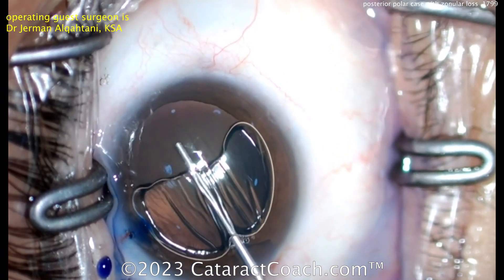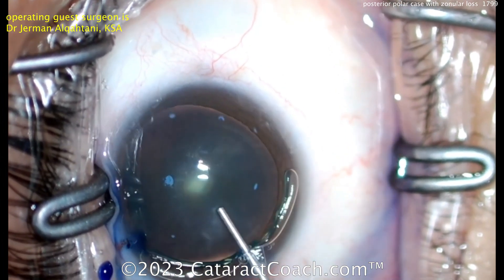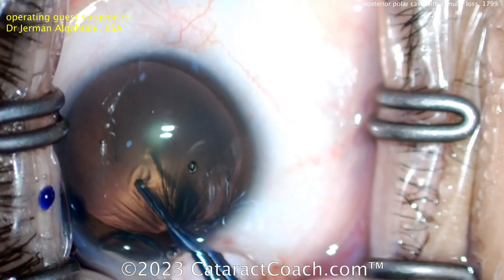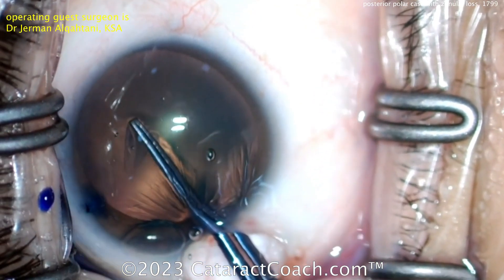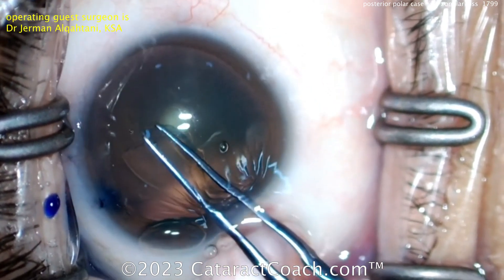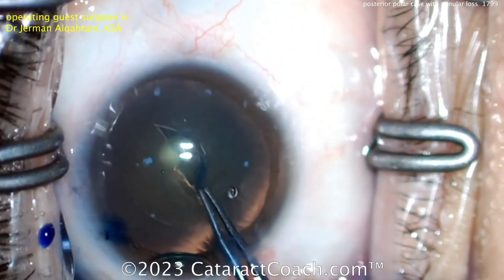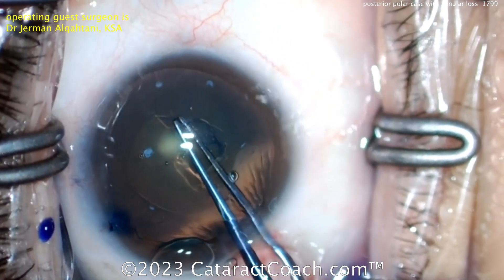Trypan blue dye going in, here's the viscoelastic, and of course a good capsulorhexis is important. As you know with posterior polar cases, you're going to be very careful — the posterior capsule can be weak, fragile, or even frankly absent at the site of that opacity. Studies by Vasavada have shown about a 30% capsule breakage rate.